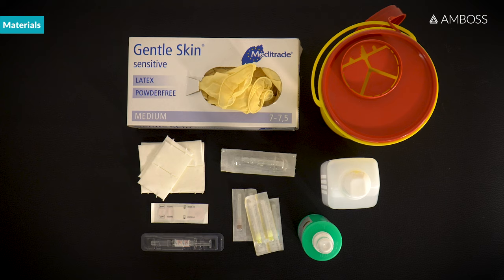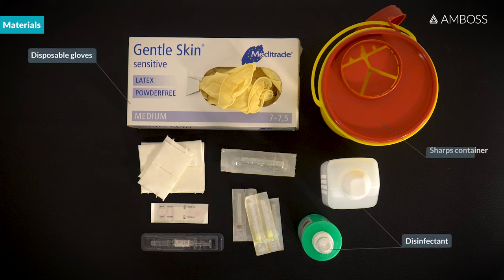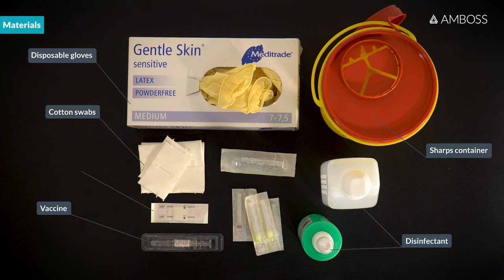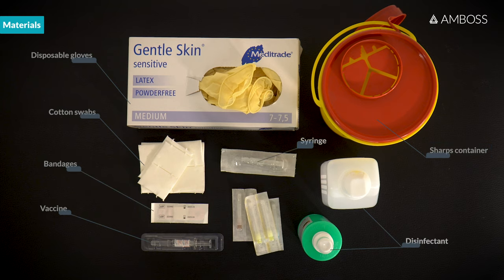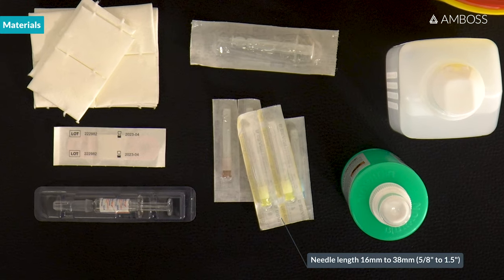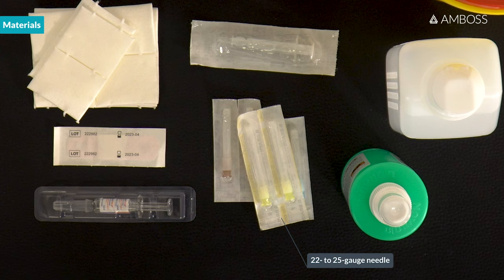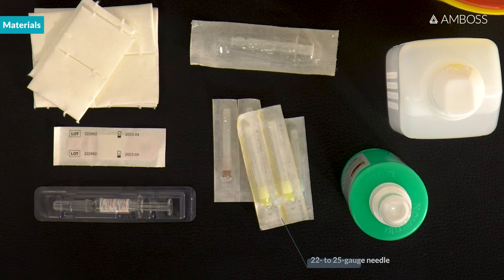You'll need the following: disinfectant, disposable gloves, sharps container, cotton swabs, vaccine, bandages, and possibly a syringe and needle. Choose a needle length and gauge depending on the patient's age and the thickness of adipose tissue. Needle lengths range from 16 mm (5/8 of an inch) to 38 mm (1.5 inches). Make sure to use a 22 to 25 gauge needle.